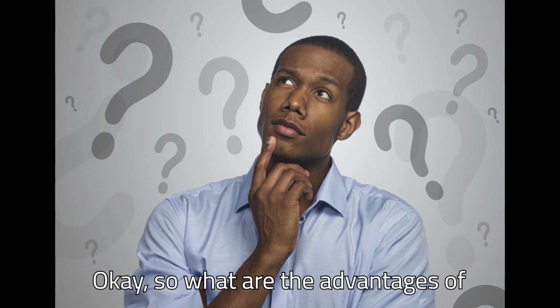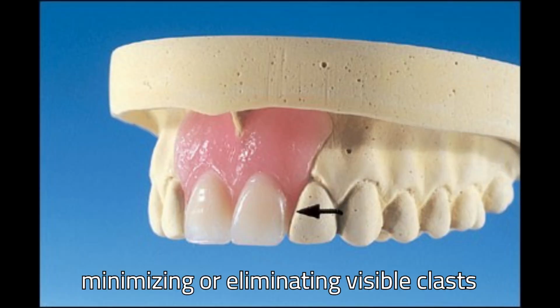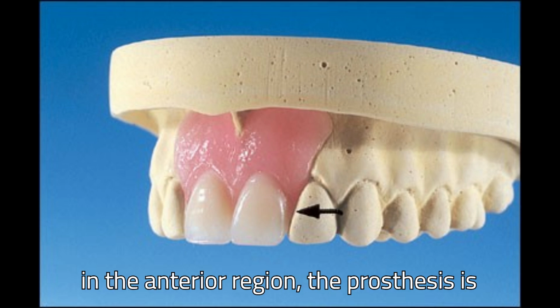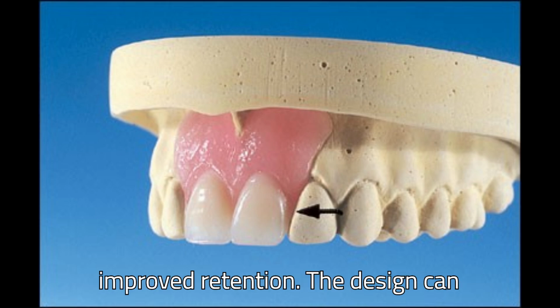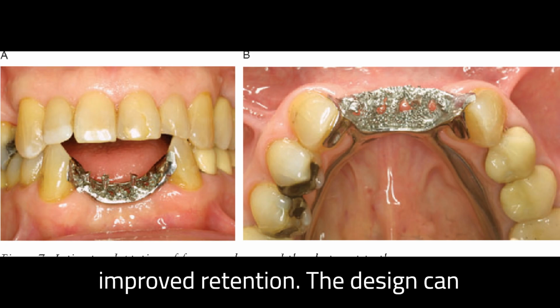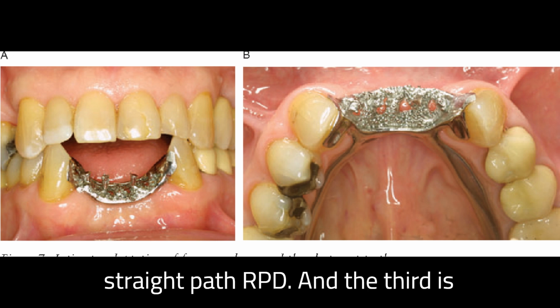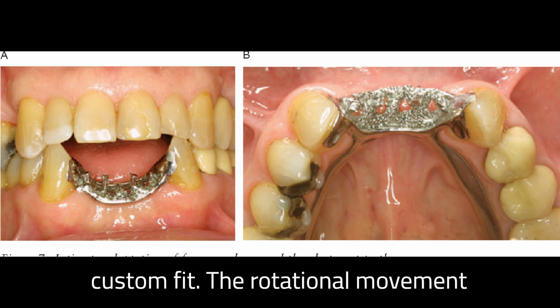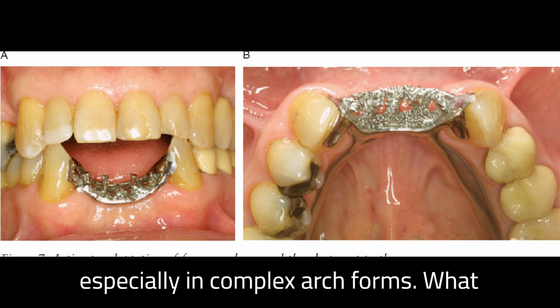Okay, so what are the advantages of a rotational RPD? First, by minimizing or eliminating visible clasps in the anterior region, the prosthesis is more aesthetically pleasing. Second is improved retention. The design can utilize undercuts in areas that would be difficult to engage with a conventional straight path RPD. And the third is custom fit. The rotational movement allows for a more customized fit, especially in complex arch forms.